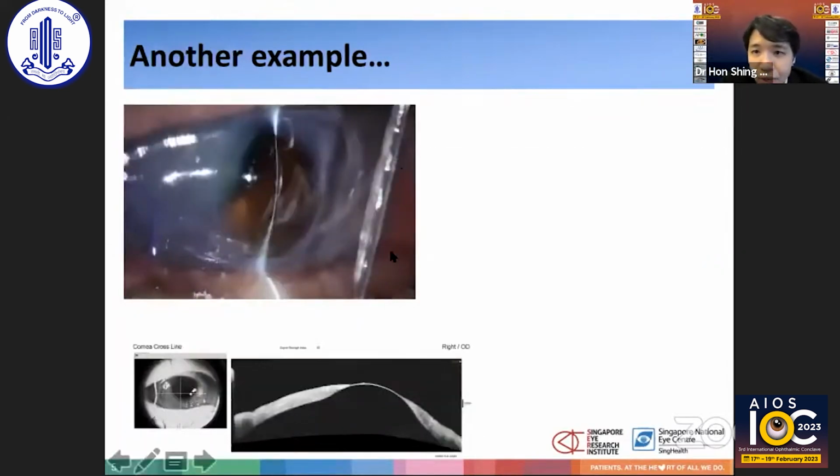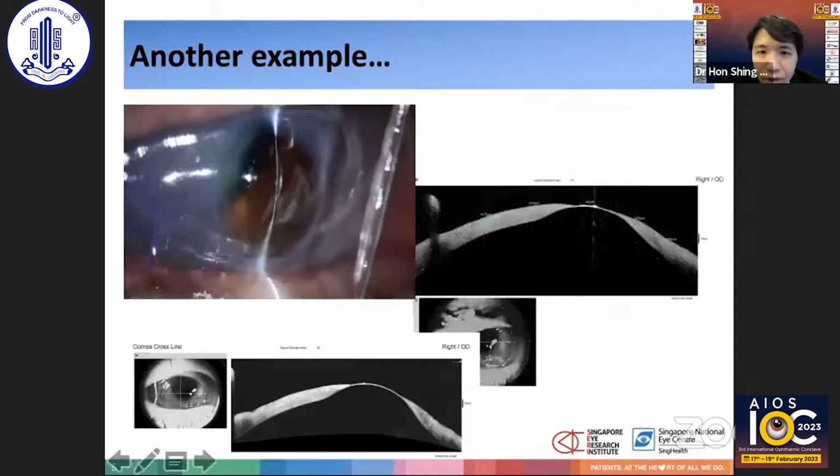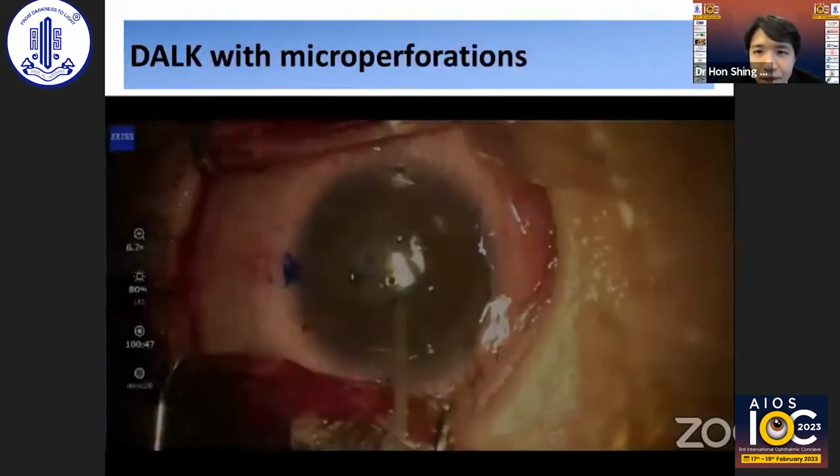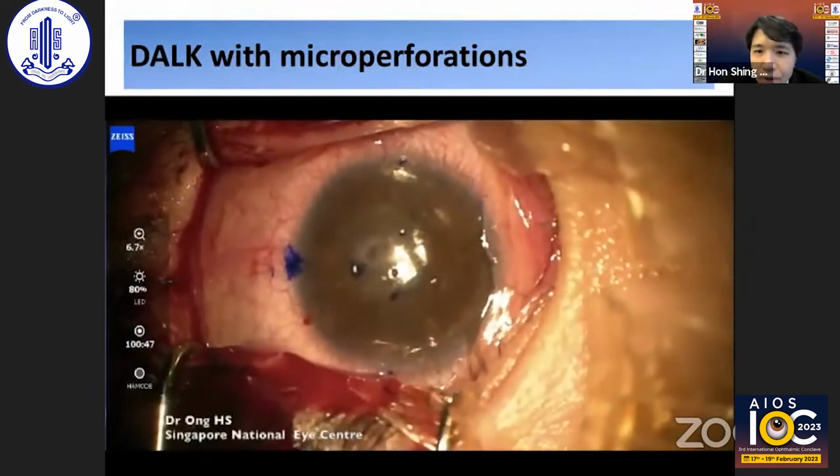And this is another patient with very poor ocular surface and neurotrophic keratopathy, which may be related to chemotherapy. And her corneal thinning has progressed to a descemetocele, as you can see on this RTView image, with thickness of only 44 microns.